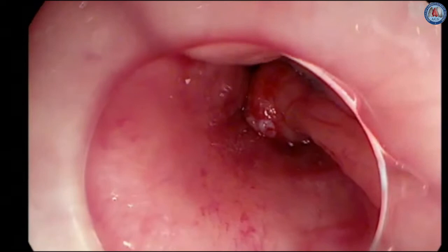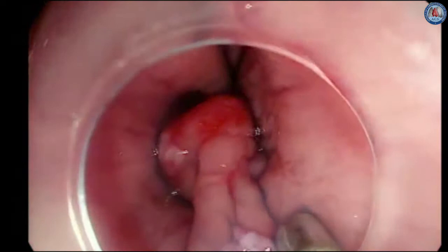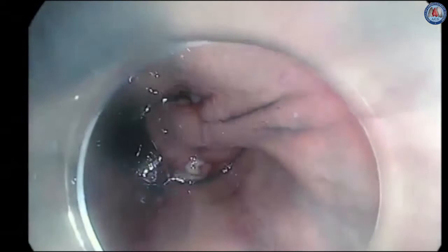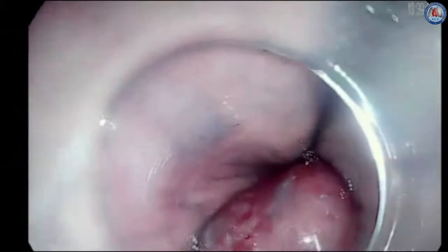In this video, I will illustrate the technique of chromoendoscopy. That's an early esophageal cancer with Barrett's esophagus consistent with adenocarcinoma. After examining the lesion, we spray the area with methylene blue. Methylene blue will be absorbed by enteric epithelium and not squamous epithelium, resulting in highlighting and defining the border of the lesion during endoscopic examination.